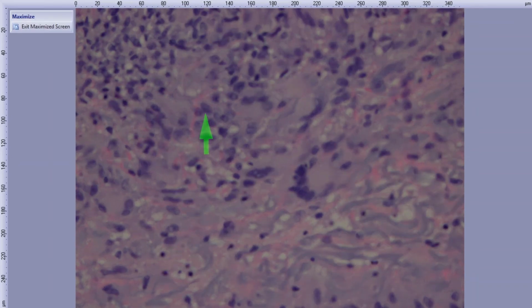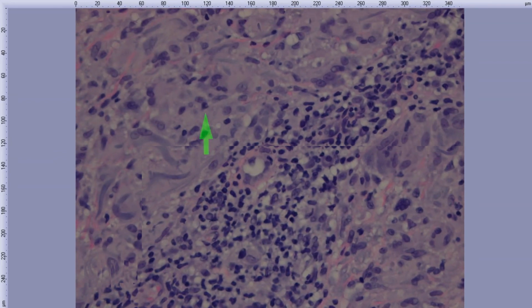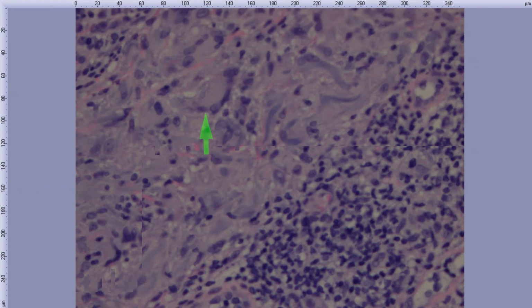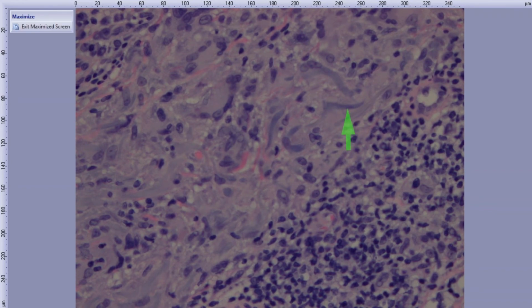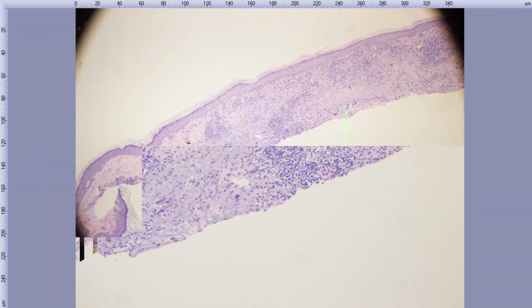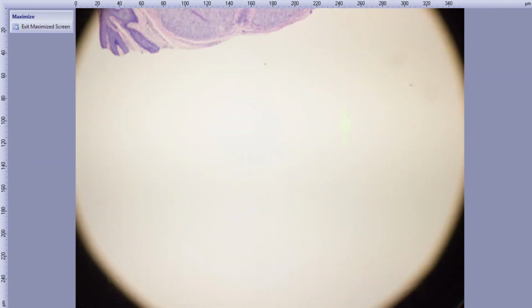Sometimes you'll see these giant cells that have almost ingested residual bands of elastotic material. So annular elastolytic giant cell granuloma. It's thought to be some kind of granuloma annulare due to chronic solar exposure. And I think we might be on our last one here.